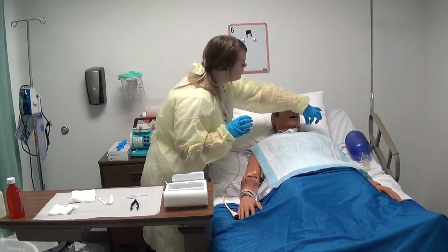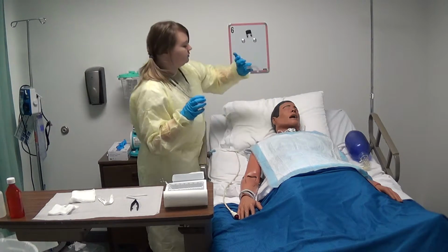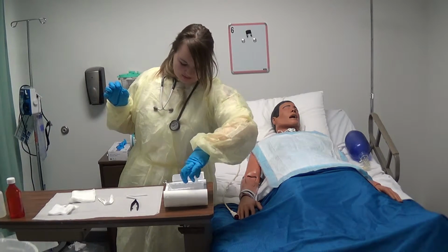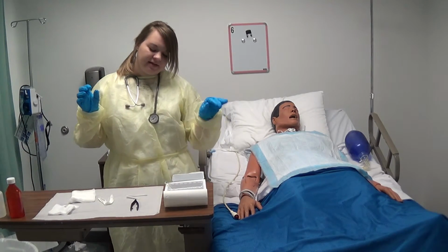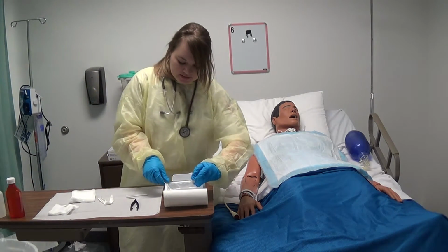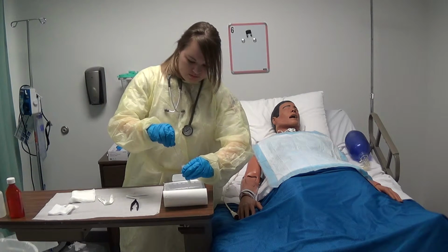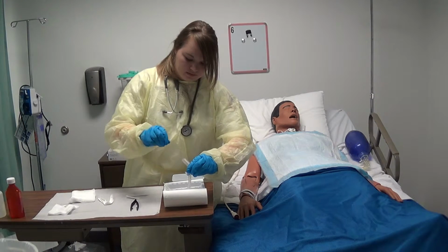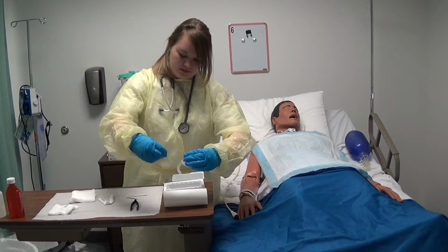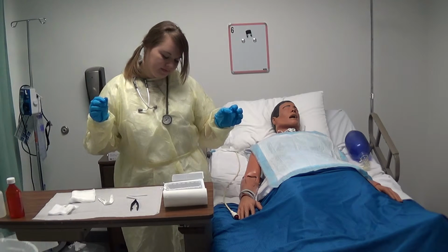I'm going to remove his oxygen and remove his cannula. I'm going to place it in the hydrogen peroxide and let it sit for about a minute. Then I'm going to clean it inside and on the outside. Then I'm going to place it in normal saline to rinse.